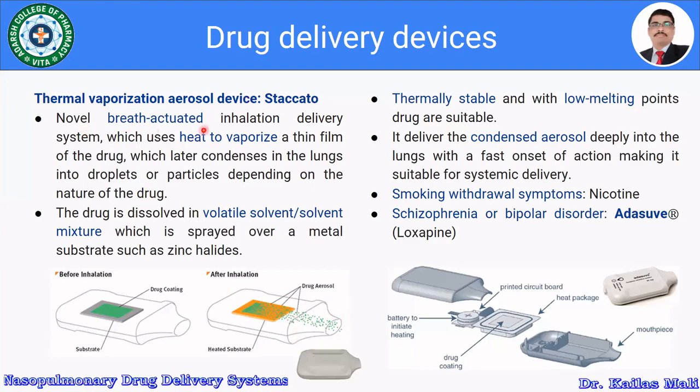This is a novel breath-actuated inhalation delivery system which uses heat to vaporize a thin film of a drug, which later condenses in the lungs into droplets or particles depending on the nature of the drug. The drug is dissolved in a volatile solvent or solvent mixture, which is sprayed over a metal substrate such as zinc halides.